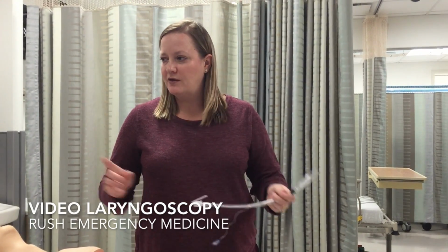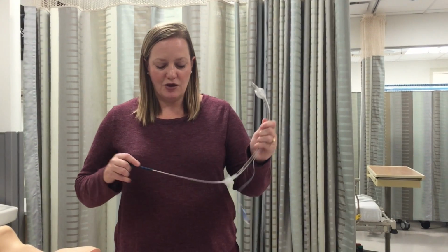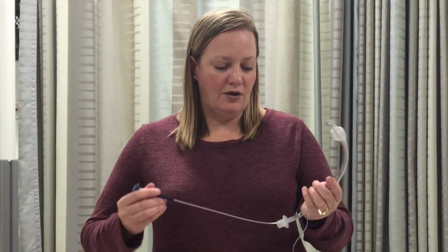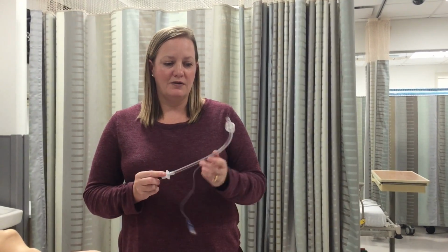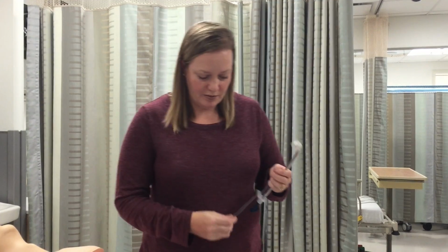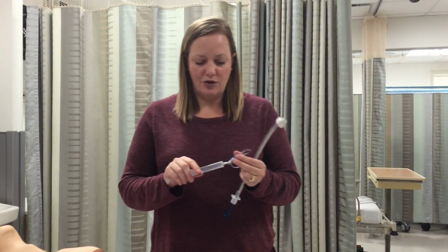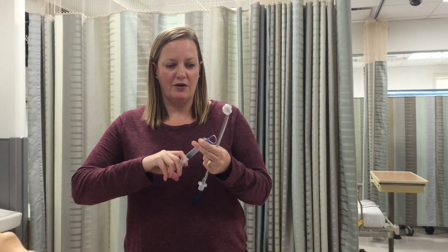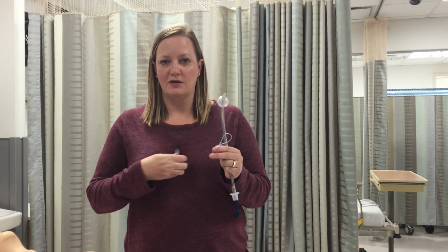We're going to start with video laryngoscopy, or the glide scope. Again, the glide scope has a rigid stylet, which is necessary for the angle of your glide scope to work. You place your stylet in your ET tube, and again, you will check your cuff. You'll inflate with 10 cc's of air. You'll make sure there are no leaks.